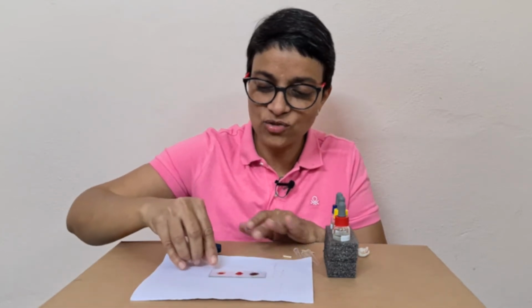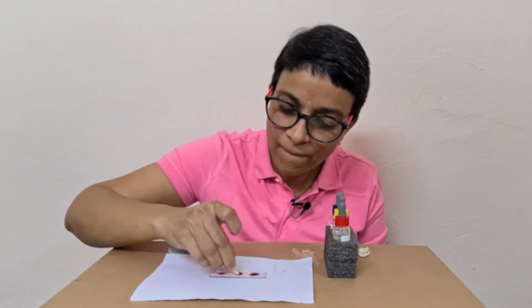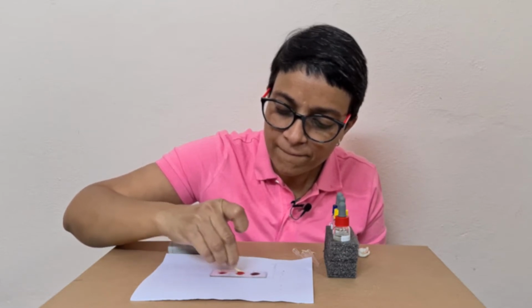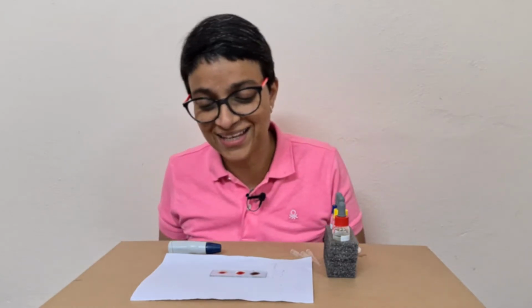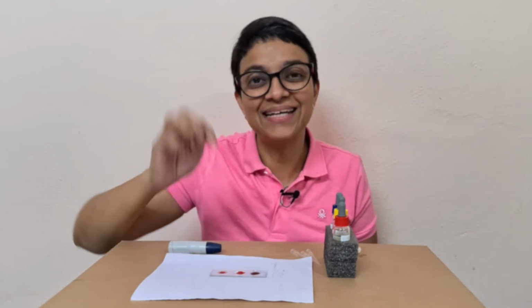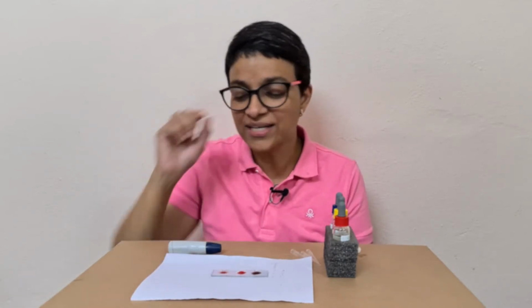You can see as we are talking, this clumping is becoming thicker and thicker. I have done this experiment so many times that I know that I'm B positive. So I'm expecting clumping in B and the last well, RH. When I post the picture, you can identify it as well.